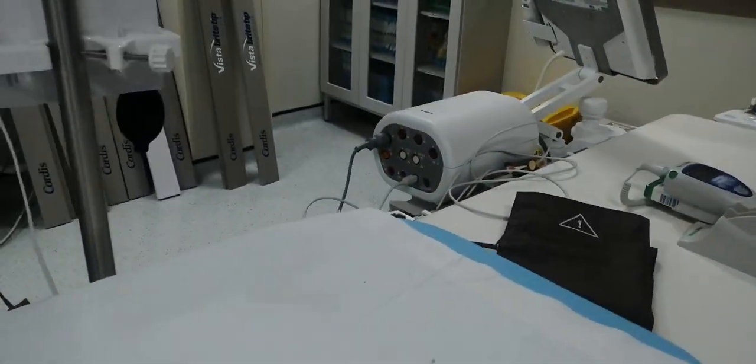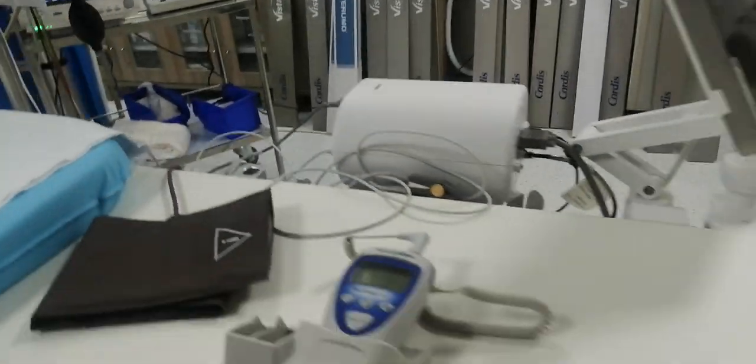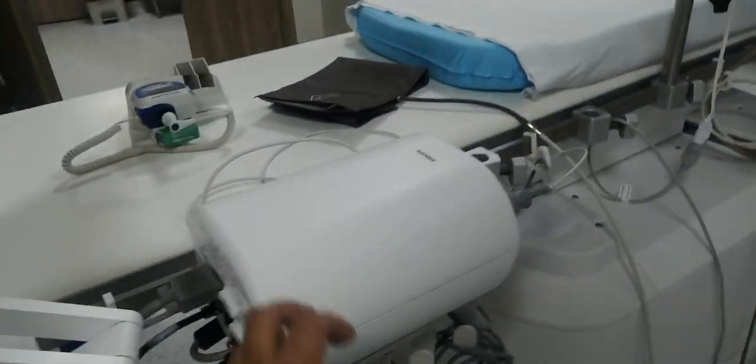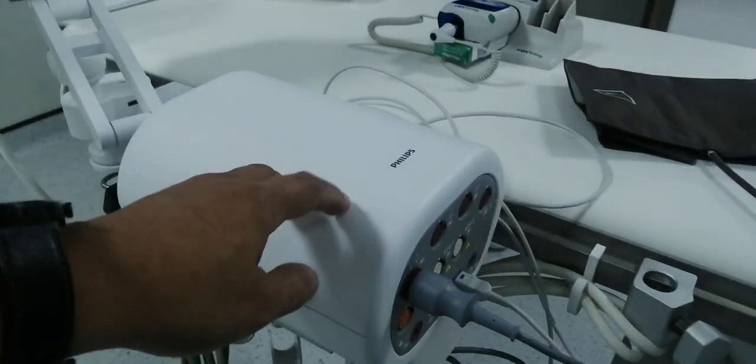That's why we brought this from the other one — the Mindray is compatible for this Philips. See, only this is the issue, this is the issue.